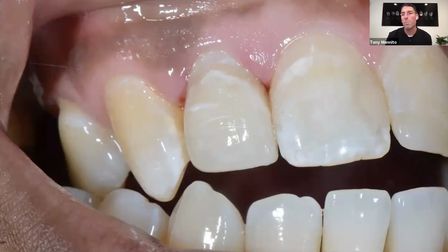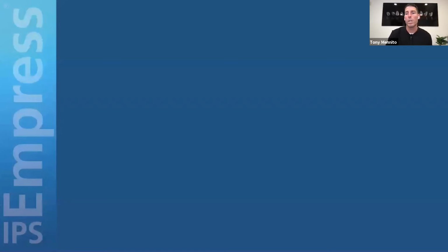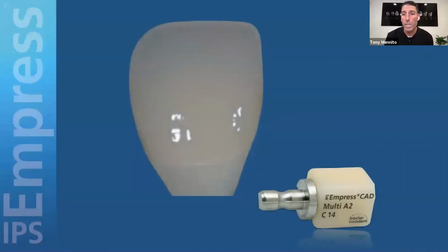One of the advantages about doing Empress in the posterior is that we don't have to stain and glaze it. We don't need an oven cycle. We can simply hand polish those straight out of the mill, which takes just three or 4 minutes, and deliver those directly. That is an incredibly efficient workflow that we can use for small posterior restorations as well. Even in a case where a patient in the posterior is opposing a complete denture or a partial denture, where the chewing forces aren't going to be so great, Empress is a really nice option there as well.